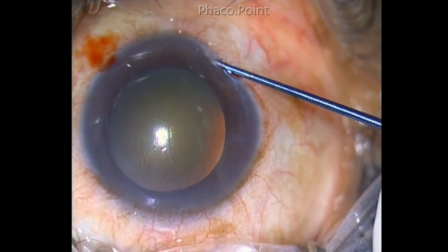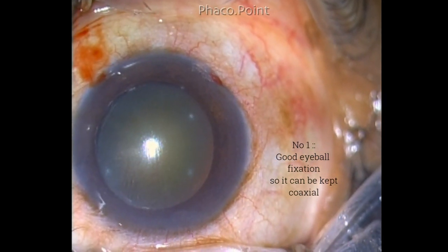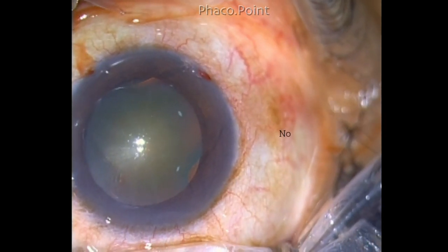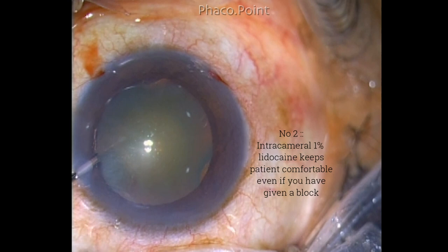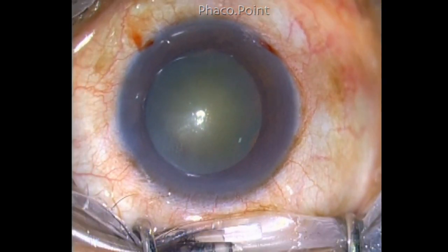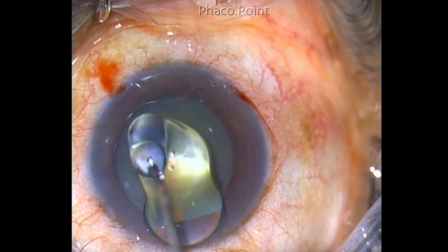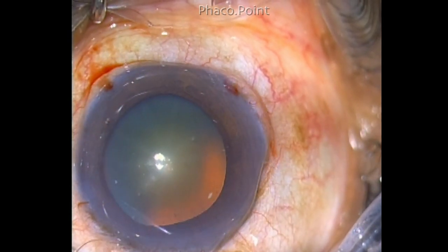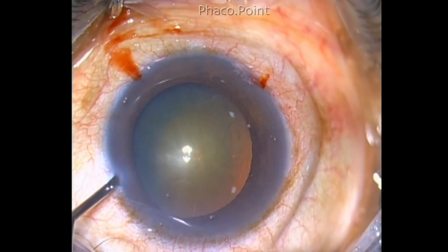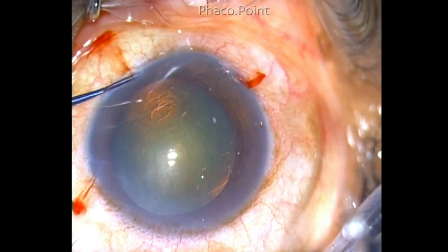This patient is being operated upon under topical anesthesia. Ensure that you've got a good fixation, whichever technique works in your hands. After making the side port incision, I inject a small amount of intracameral lidocaine, say 0.1 to 0.2 cc. Intracameral lidocaine has a lot of beneficial effects even if the patient is blocked, because it tends to keep the pupils dilated and also anesthetizes the iris. The anterior chamber is then filled up — not entirely but enough — with two percent hydroxypropyl methylcellulose.